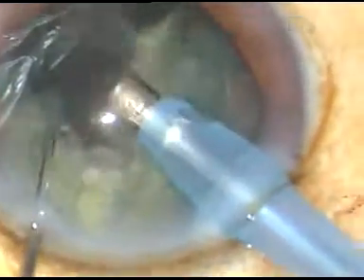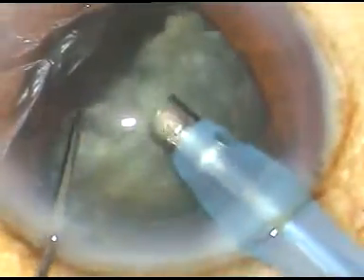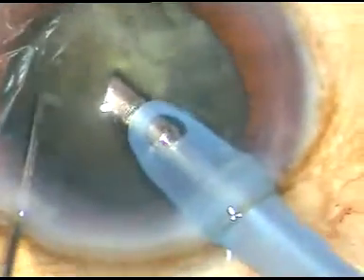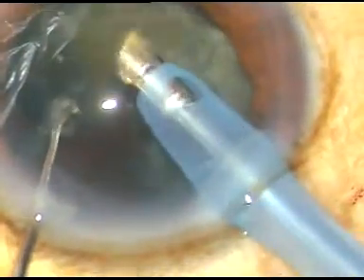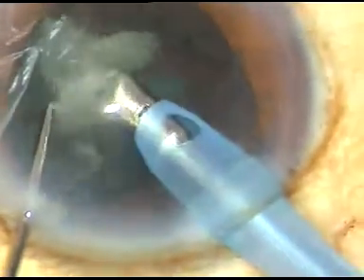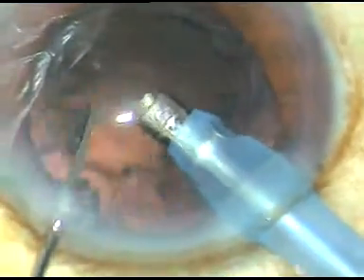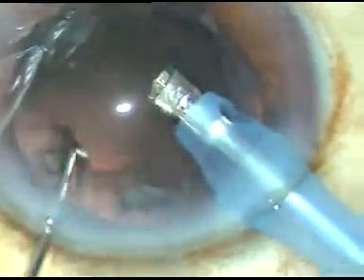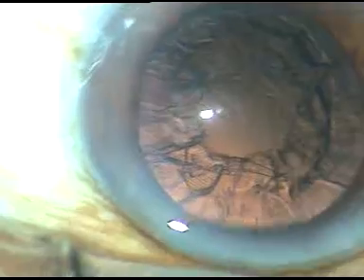And this is emulsification of each fragment. From the very beginning, I am in phaco 2 mode, and in phaco 2 mode the ultrasonic energy in this case is 60%, flow rate is 45 ml per minute, and vacuum is 450 millimeter of mercury. This is the last fragment. Antechamber is very stable. Now all the nuclear fragments are removed.